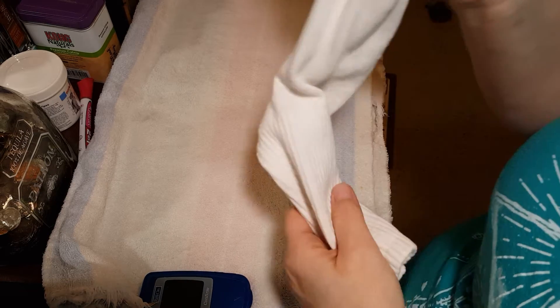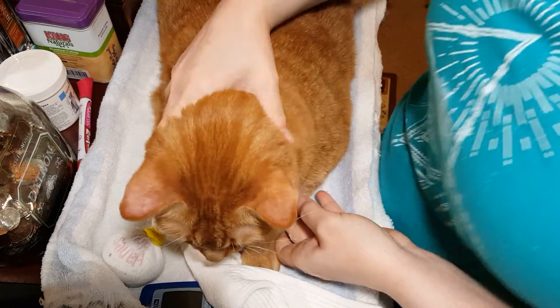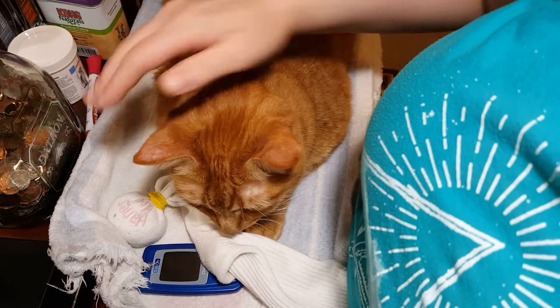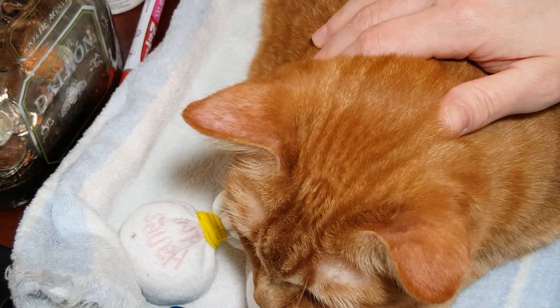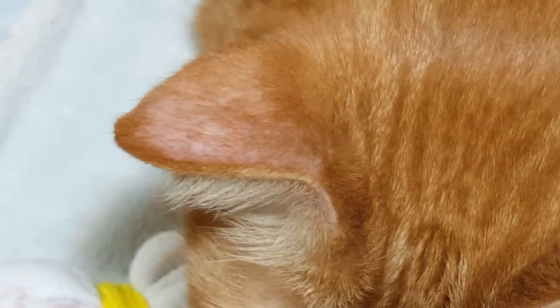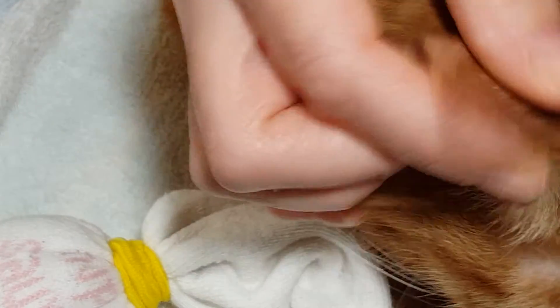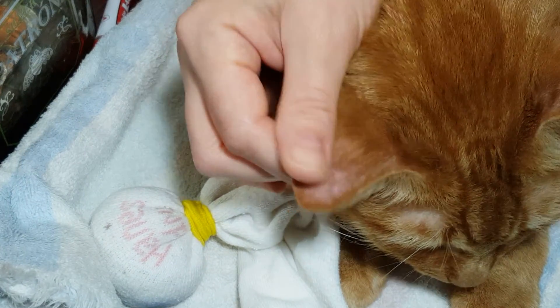I will get Peanut now. You just woke up! I need to kind of position the camera to make sure that you can see his ear clearly and what I'm going to be doing. Okay, just make sure he doesn't move around. It's okay. Maybe not so zoomed in.